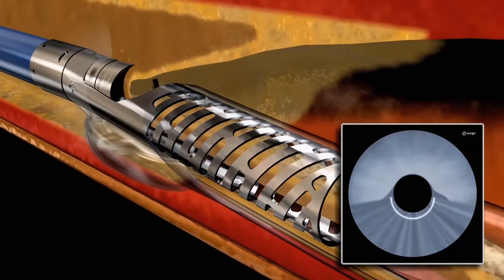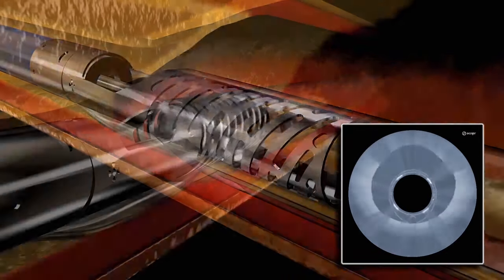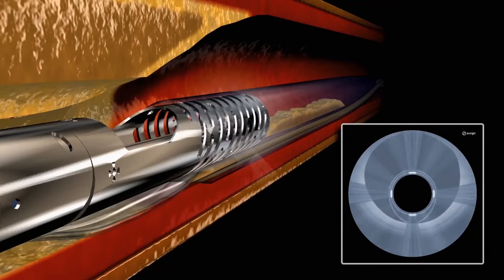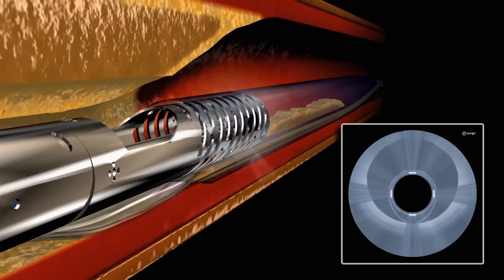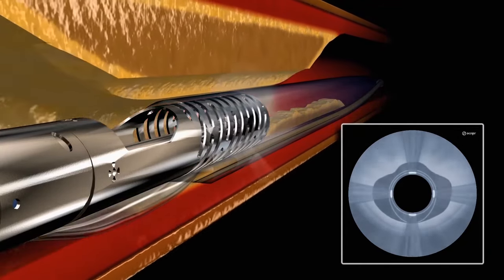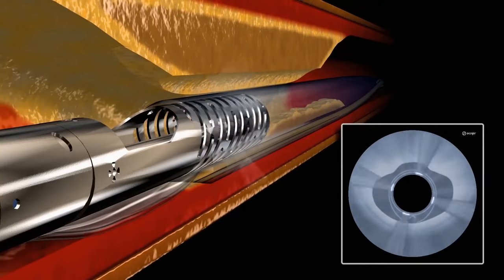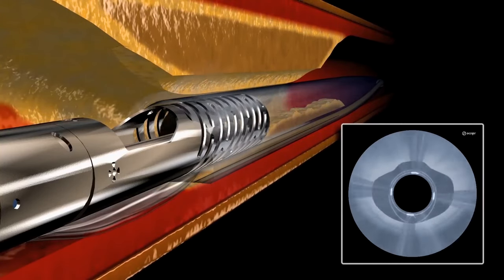An onboard imaging system combines with the plaque excision mechanism to provide live views from inside the artery, indicating which treatment areas to target and which areas to avoid in order to preserve the native vessel architecture.